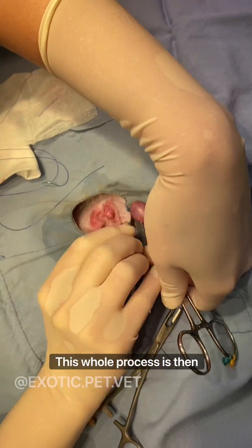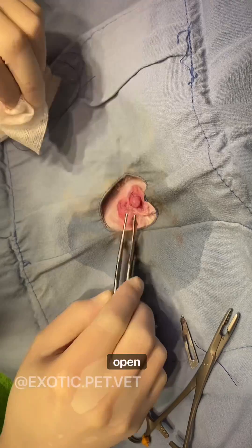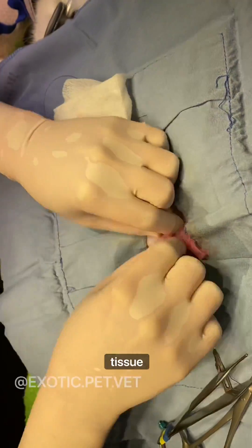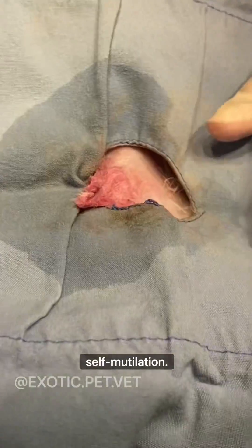This whole process is then repeated with the other testicle. The skin incision can be left open, just aligning the edges together for a few seconds, or it can be closed with tissue glue. Sutures in the scrotal skin are contraindicated as they can encourage self-mutilation.